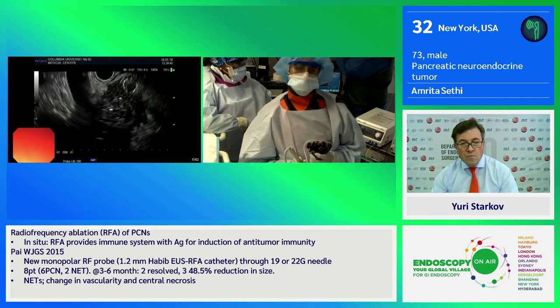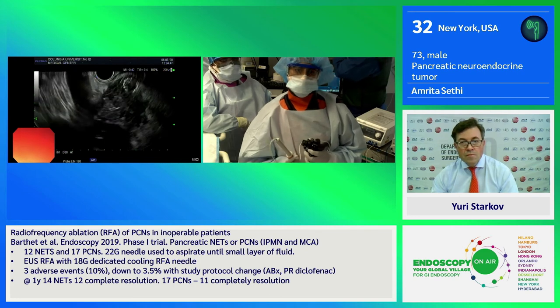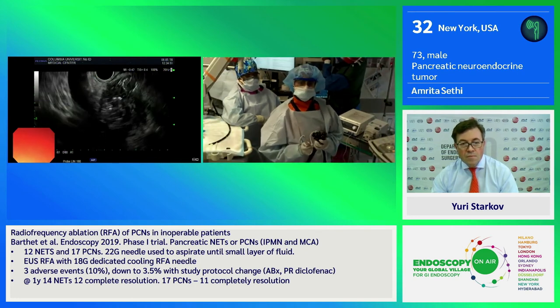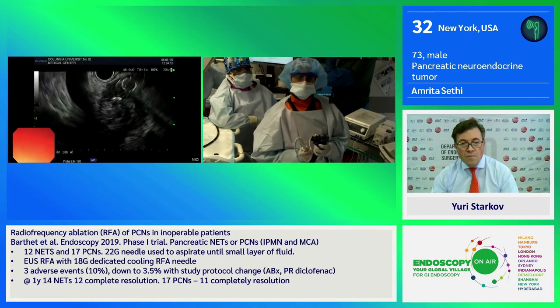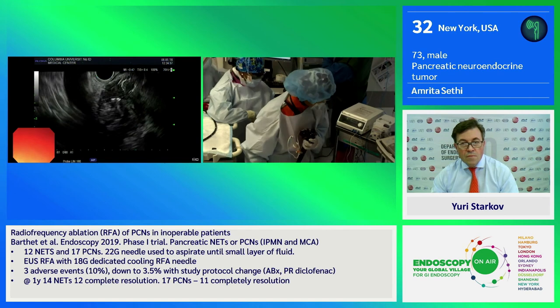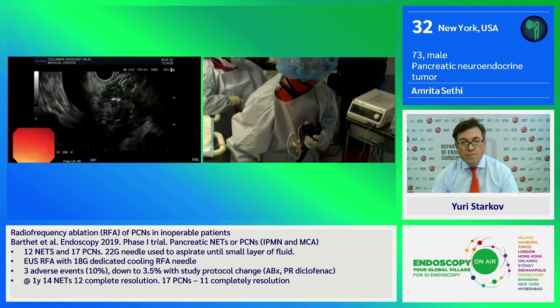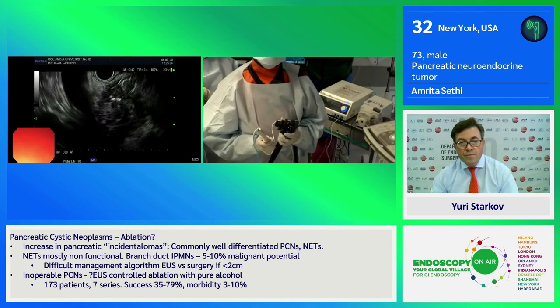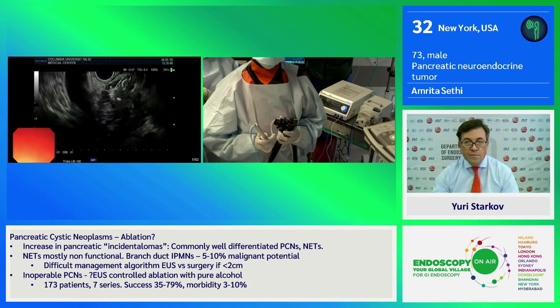Now I will come up with the catheter and actually try another treatment just at the top edge here. Start it again — this will be another 20 seconds. There you can see the bubbling. So the ablation is ongoing.